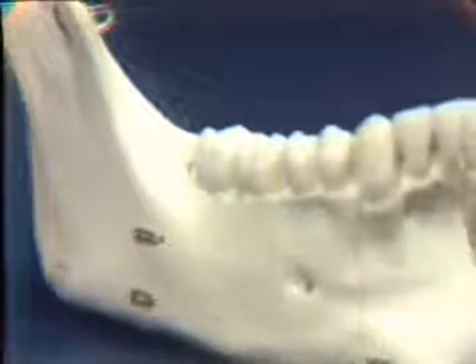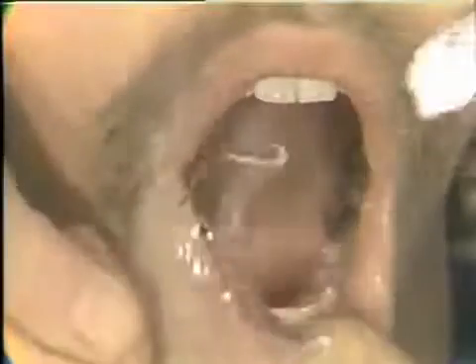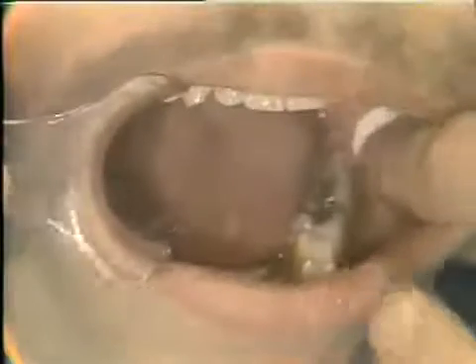All right, let's go to the patient. We ask our patient to open for us, and once again we're going to retract on the opposite side. This throws a little more light in here so you can see a little better. I'm drying the mucosa again with our gauze pad just as before, and then we retract his cheek, as you can see here, and this creates tension in these tissues in the vestibule at our injection site. And we'll paint a little tincture of betadine here on our injection site.